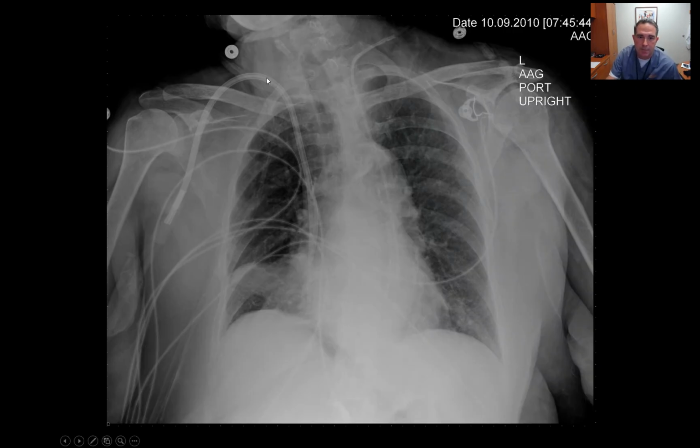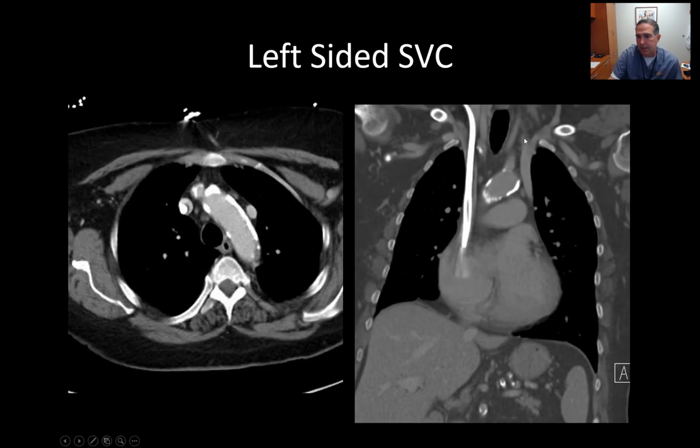This is an HD catheter, and then a new left-sided central line was placed. We'd expect it to cross midline. It goes straight down. That's a little worrisome. You worry that it's in the aorta. Pulled up an old CT, and turns out they have a persistent left-sided SVC. So it makes you feel a little bit better about that. Sometimes there could be a test question that says, where does a persistent left-sided SVC drain? The answer to that question is C, coronary sinus.